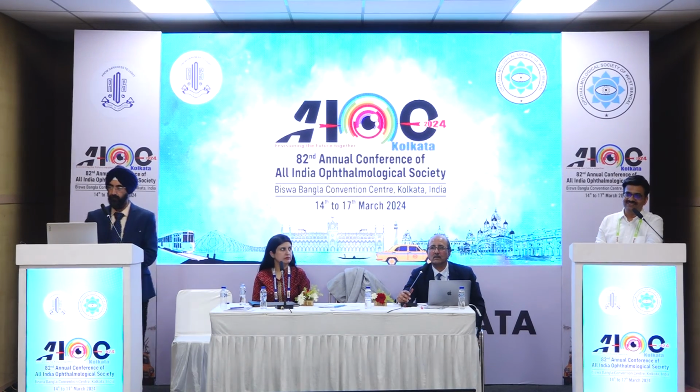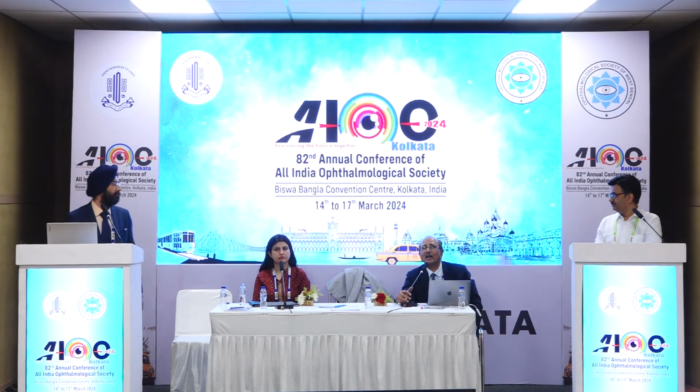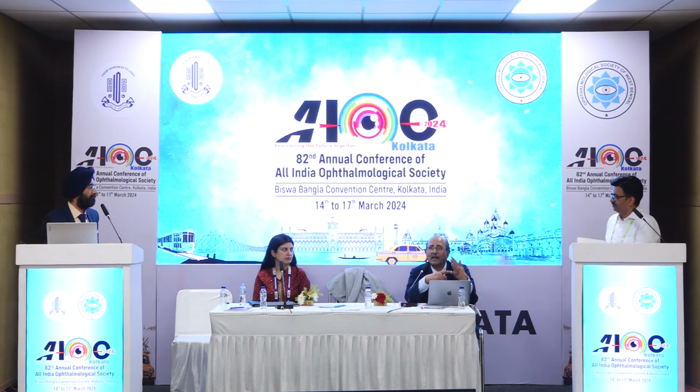I would say it is still 50-50 SRK/T and Barrett's. When we started pediatric cataract surgery, I used to initially use SRK II, about 35-40 years back. Then we shifted to SRK/T.